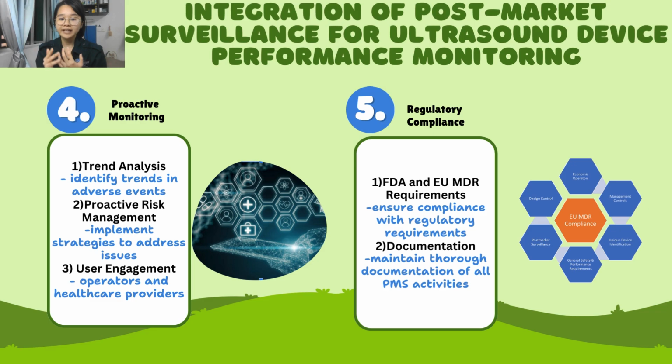Finally, ensure compliance with regulatory requirements set by bodies such as the FDA and the EU Medical Device Regulation, in short form MDR, and maintain thorough documentation of all surveillance activities, including adverse event reports, customer feedback, and clinical data. And this integrated approach helps ensure the ongoing safety and efficacy of ultrasound devices after their launch, and this also can be explained simply using the diagram as shown in the slide.